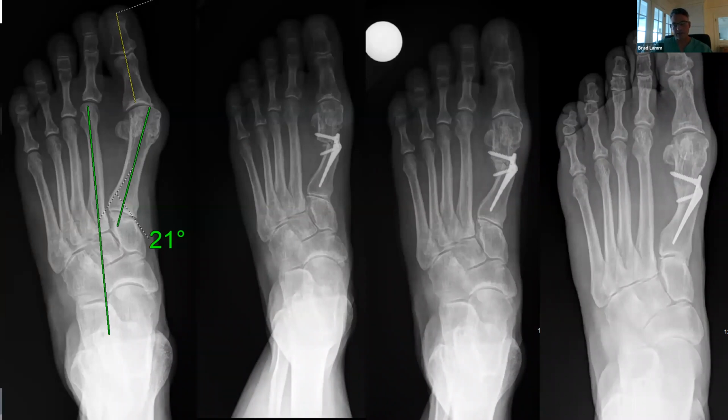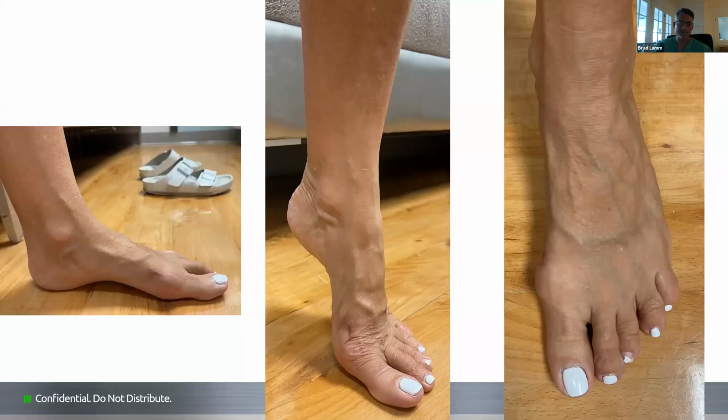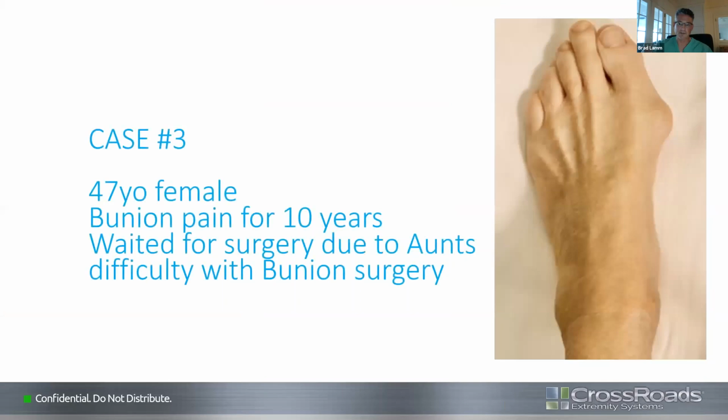You can see this is a 4-5 implant. There's a 3-5 and a 4-5. This one's a little bit larger in width to push a little bit more to get more lateral translation. You can see nice remodeling of the lateral aspect of the osteotomy. And here you can see really good function, not too much in the way of scar. She was really pleased, functioning well.